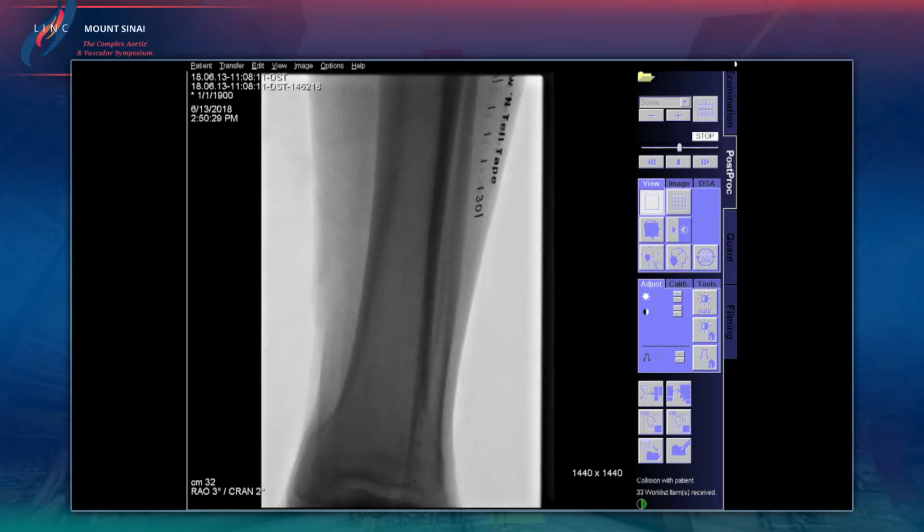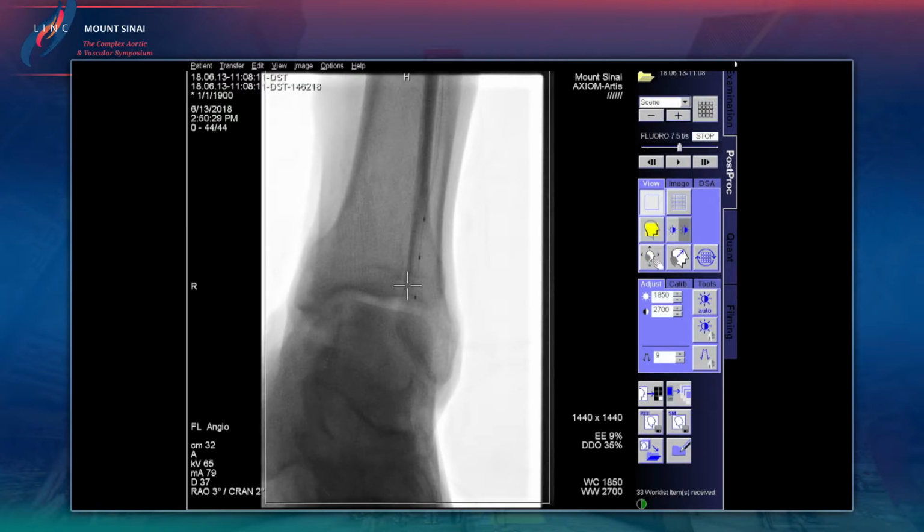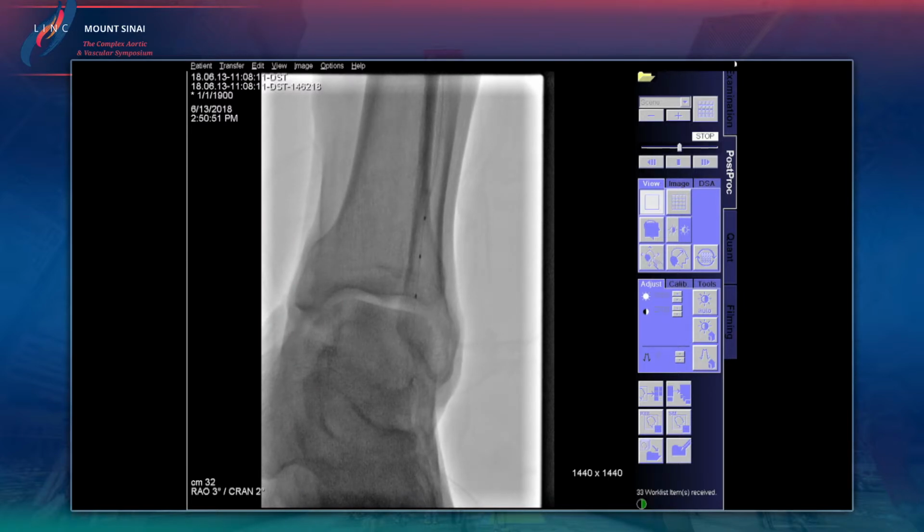I agree with you. I think at this stage, having taken that picture, I feel a hell of a lot better with doing what we decided to do. But as far as durability, interestingly, the drug-eluting stents are open. The DESs look great. Yeah. So the question is, that's what I want to ask you. So what would you guys do in terms of trying to, would you use a whole bunch of DESs here to keep this open, or how would you deal with this?